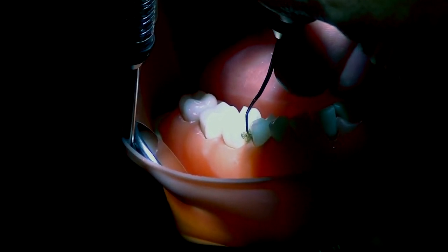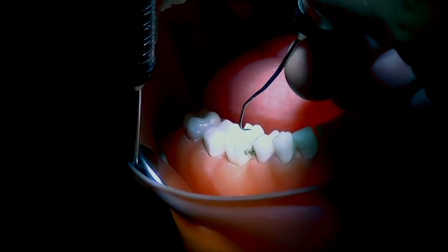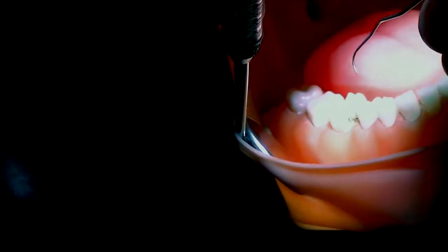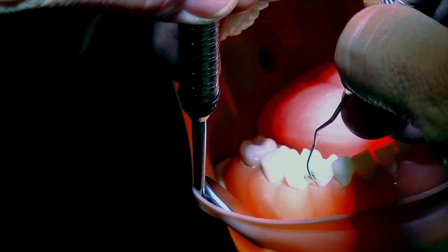You want to go to the midline of the tooth in between the teeth, and then work your way up underneath the contact, and then around the contact to the top of the tooth. So it's short, overlapping, vertical strokes interproximally. Then you're going to turn your instrument so that you're using the other side of the tip.